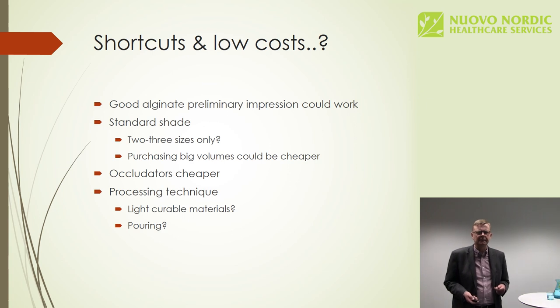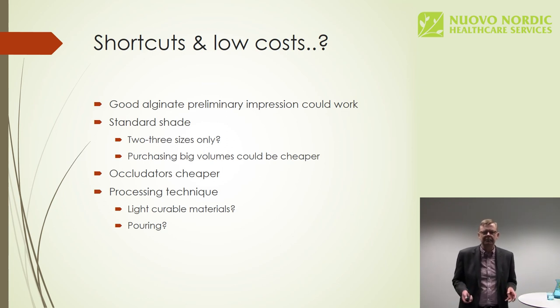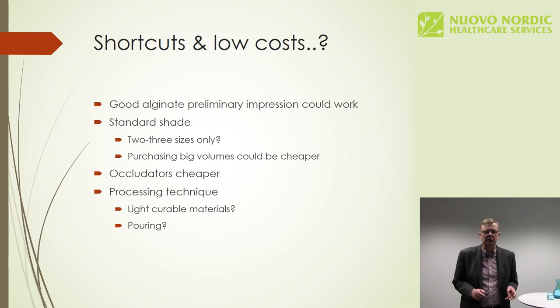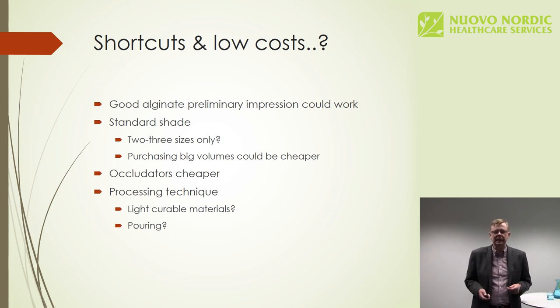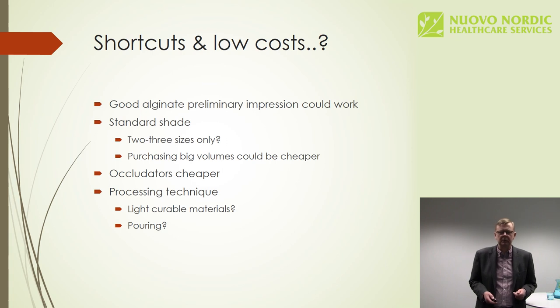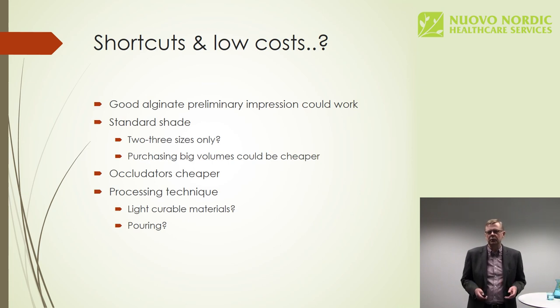My suggestion is that if you don't have a good selection of teeth, or you would like to limit ordering different kinds of shades or sizes or shapes, you could have only two or three of the most often used sizes or shades. As later we'll see, there are lots of articulators or occludators. If we try to simplify the fabrication, perhaps an occludator could be just as good as any for this work. And then also the actual processing of the dentures, whether it's possible to use injectable materials or even poured acrylic, well, it's up to you.